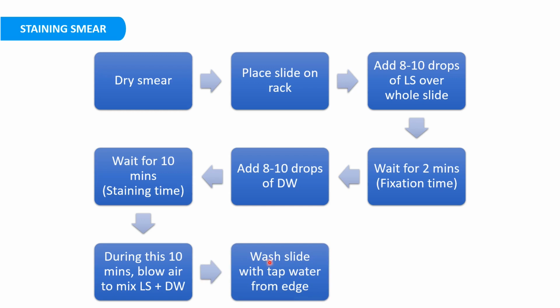Then after 10 minutes we have to wash the slide with the tap water from the edge, not directly on the smear. If you allow the tap water directly to fall on the smear, it will wash away. So you need to keep in mind that the tap water should be falling on the edge of the slide, not on the smear.